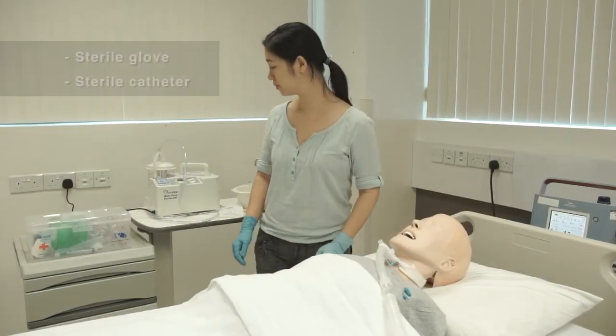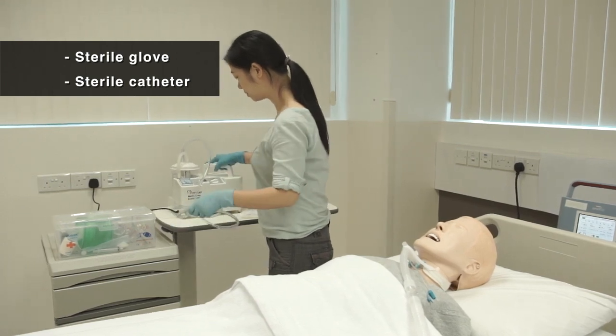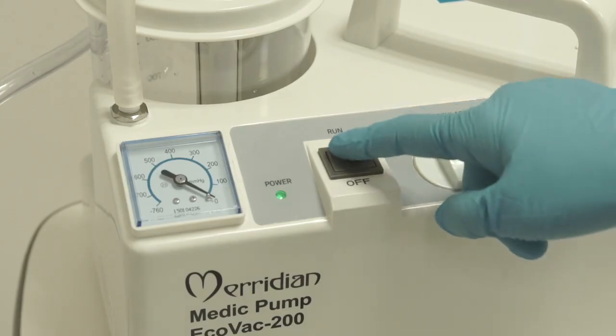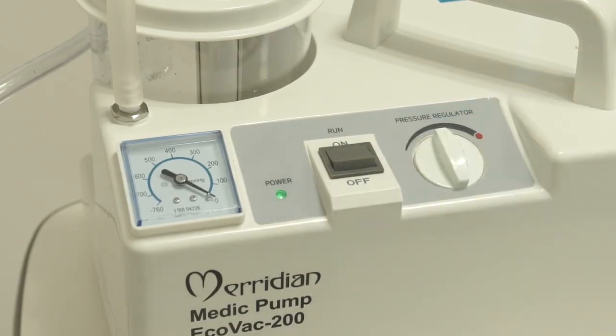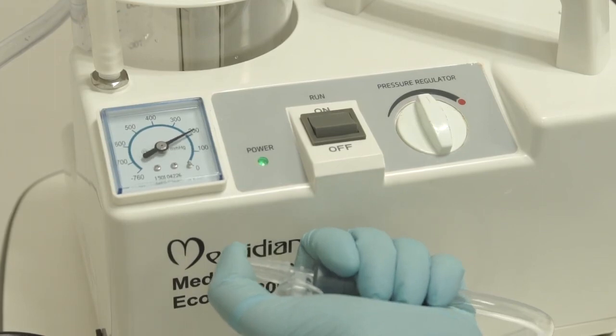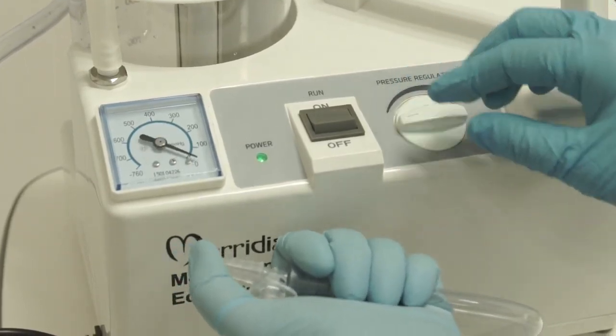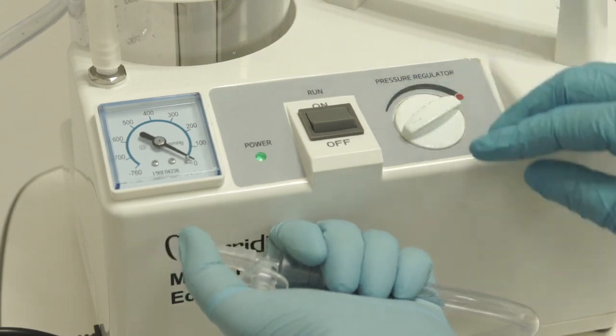Tracheostomy suction is a sterile procedure. You must wear sterile gloves and use a sterile catheter. Switch on the suction machine. Cover the tip of the suction tube with your finger — if you feel the suction pressure, the machine is functioning. Adjust the pressure to 80 to 120 mmHg.